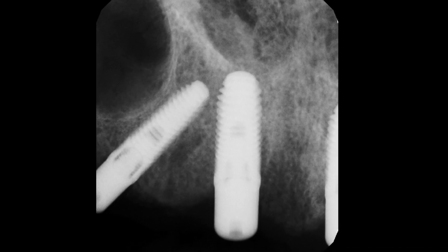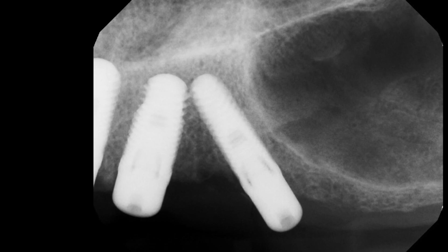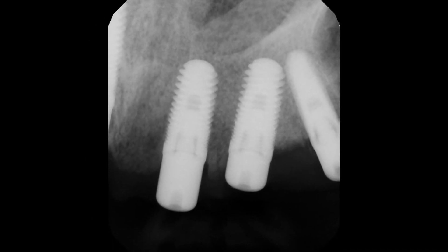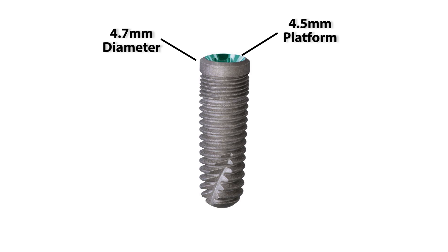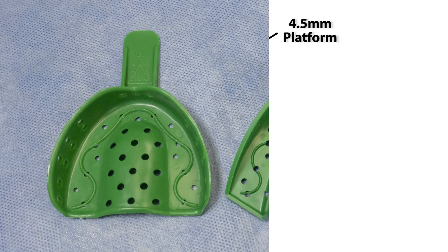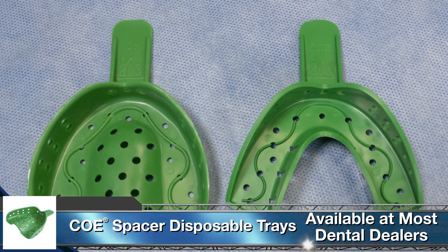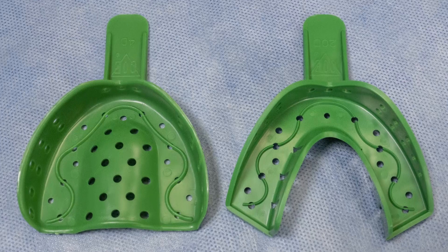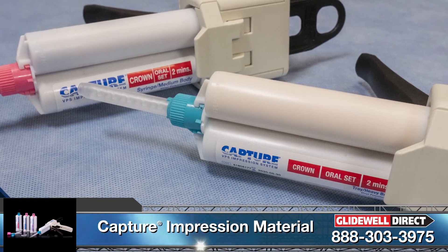Today's case will demonstrate a full-arch, open tray impression. Similar to many patients that you will see in your own office, this patient presents with implants already placed and integrated. Prior to today's appointment, I have identified several things: the specific type of implants which were placed, the diameters, and if there is a restorative platform shift involved. It is worth noting that with some systems, the diameter of the implant body is different from the restorative platform. For today's video, I am going to demonstrate the very basics of taking an open tray impression. Keep in mind that this is a preliminary impression, using individual transfer copings and a stock tray. This impression will be utilized to provide our lab with valuable foundational information.